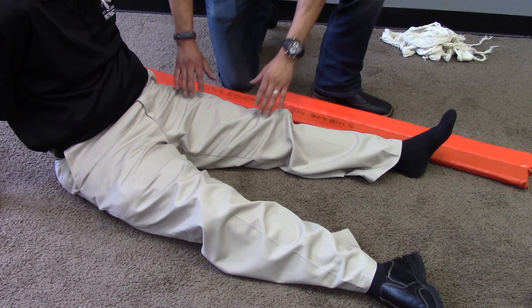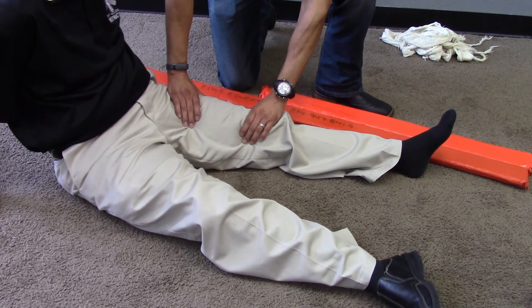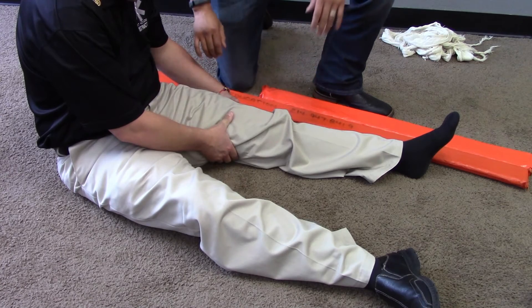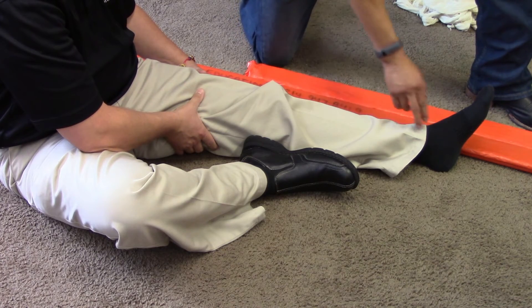Direct application of manual stabilization of the injury. Assesses distal motor, sensory, and circulatory functions in the injured extremity.